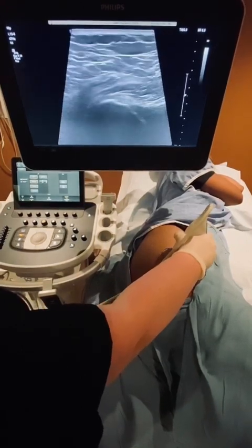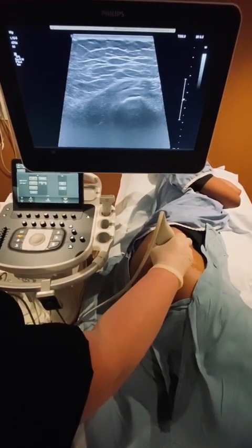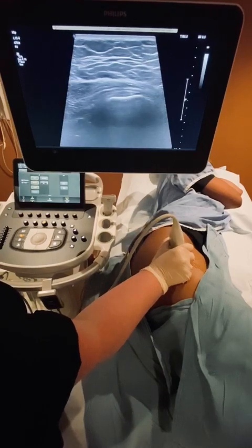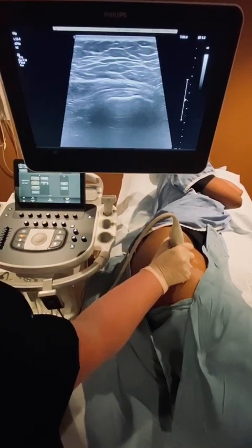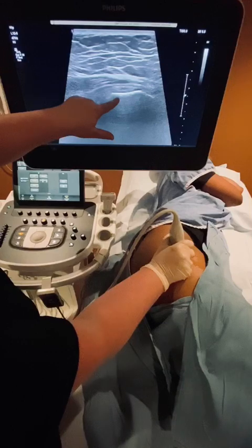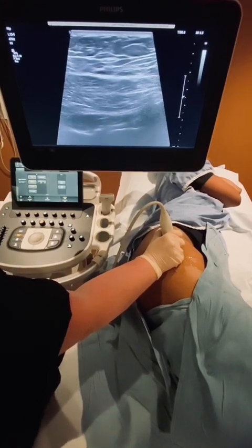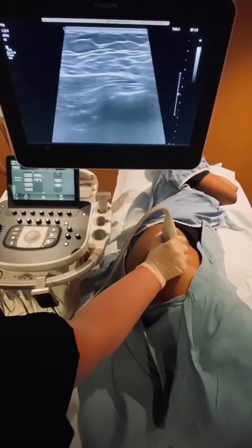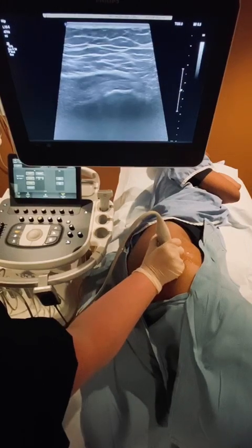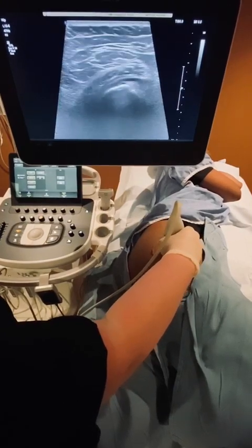Now come back to the apex and move the probe posterior to focus on the gluteus medius tendon. Turn the probe clockwise to elongate the gluteus medius tendon, which is usually a more prominent tendon. Your probe is now more straightened down and in line with the leg. This here is the lateral facet and this is the gluteus medius tendon. If I slide the probe more proximal, you can see the gluteus medius muscle. Same technique — sweep in the long axis from anterior to posterior, then sweep in the short axis from the distal insertion to the proximal myotendinous junction.